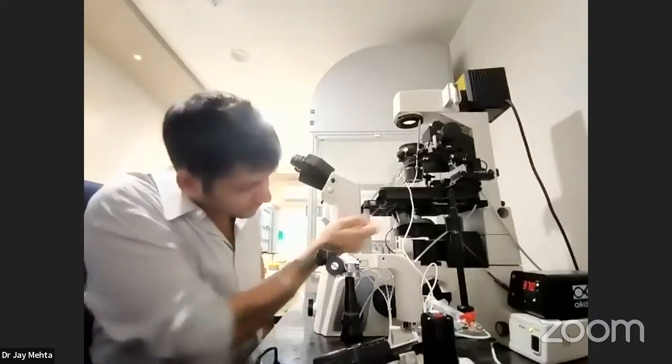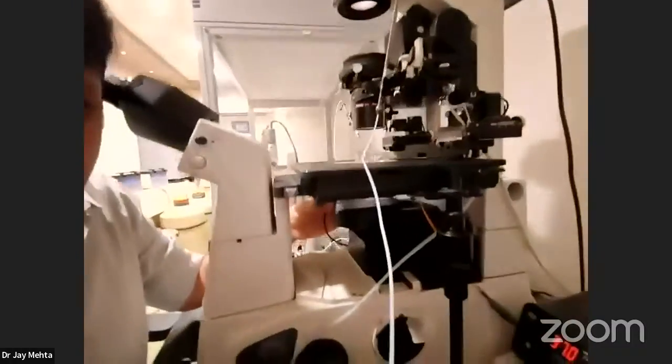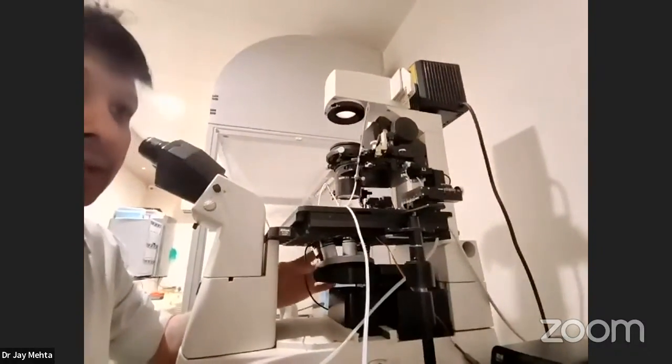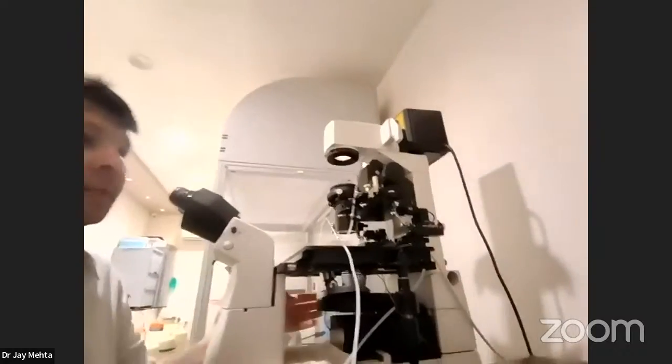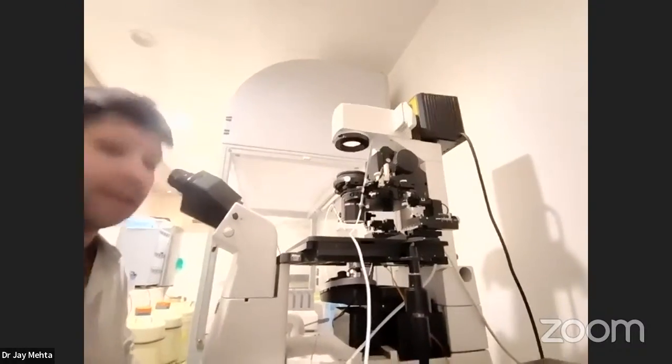So what typically happens is, this is the lowest grade of magnification. As you can see, the lowest grade of magnification on an operative microscope comes to approximately 4 times. I don't know if it is correctly going to be visible, but you have various focal lengths which are present here. So I'm going to be changing the focal lengths and I will be going to the standard magnification, which is approximately 20 times. And I want to increase, so I've increased it and I've gone to the magnification at the time of laser hatching. Laser hatching is one of the highest magnifications which is possible, and I have gone to that. I will just show you the screen now.